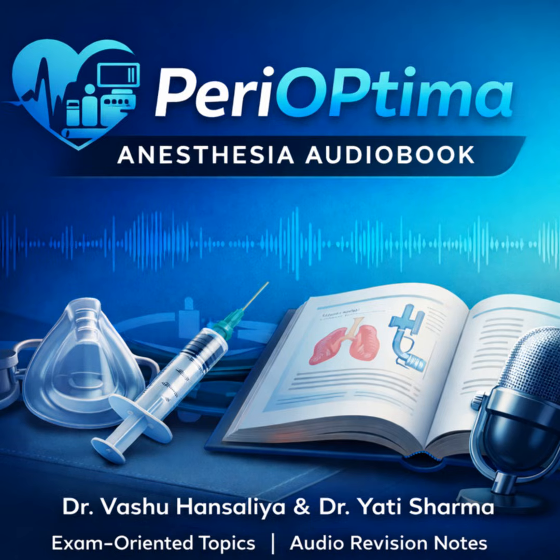Now, on to the critical oxygen failure safeguards. These are mandatory in all modern machines. How does the machine actually detect and then react to a drop in oxygen supply? We have two highly integrated systems here. The first is the oxygen supply failure protection device. Okay. This device's sole purpose is to interrupt the flow of all other non-O2 gases, so your N2O, your air, when the pressure of the oxygen supply drops below a critical threshold. And what's that threshold usually? It's typically around 20 to 30 psi.